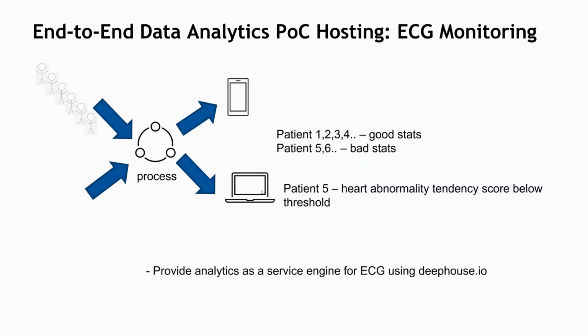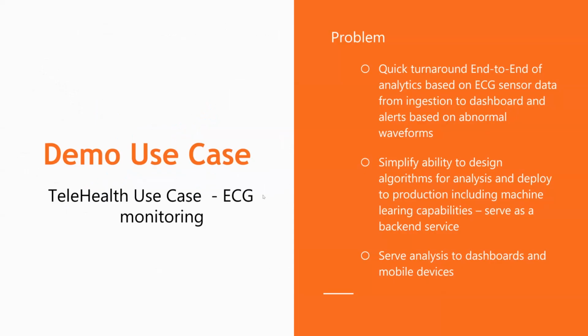Let's imagine one such company who wants to extend their SaaS offering to this use case, starting with a POC and taking it to production in case it's well received by the decision makers. And that is all about time to market with minimum amount of overhead. DeepHouse.io provides a solution through its simple but interconnected services. Let's narrow down the problem statement and the solution in the next slide.